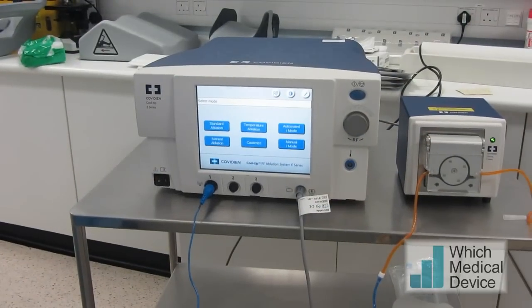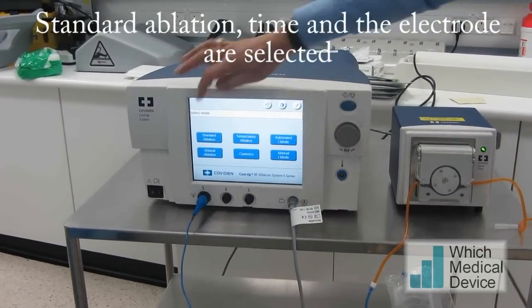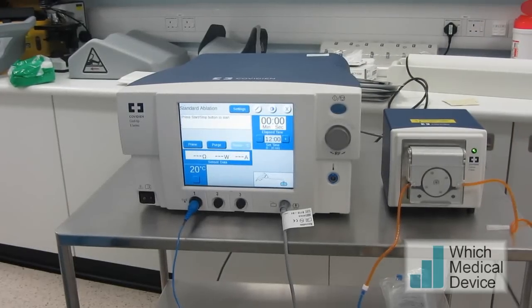It's a very simple machine now, much easier to use than the previous version. All we need to do here is press standard ablation and the machine pretty much does the rest for us. Then we select the electrode, and the time is set to 12 minutes.